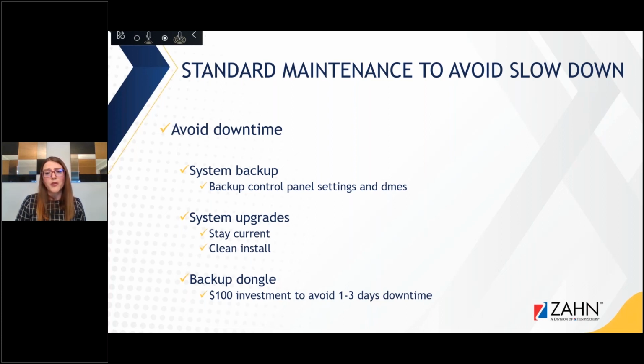System upgrades, it's very important that you stay current. So every once in a while, things will stop working because a graphics card driver update changed some setting that doesn't work with older versions. And this goes for any software, not just 3Shape, really.